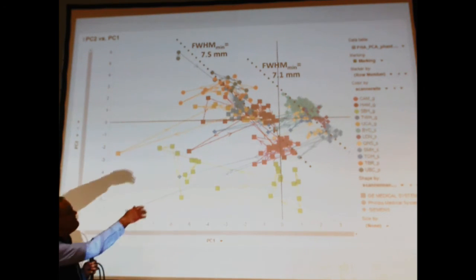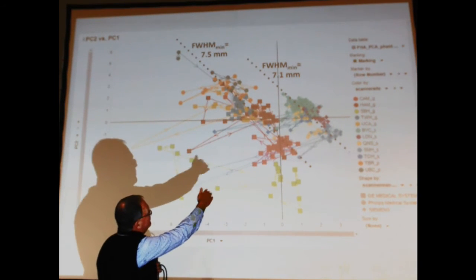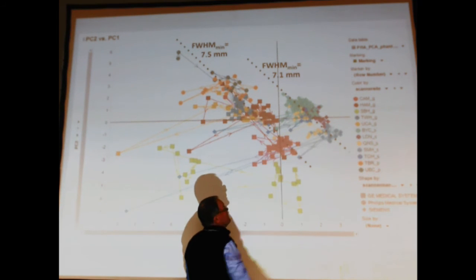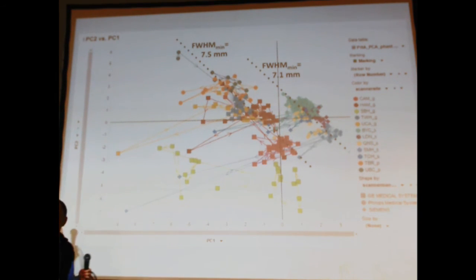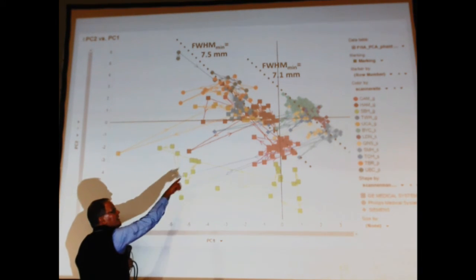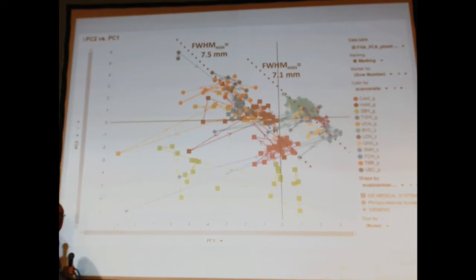So in fact we have on average got, these are all the GEs and Philips here, and they're the Siemens there. So we've certainly brought them closer together. So it's doing, first order, what you would hope it would do. But remember, that is a resolution direction. It's creating all these outliers. So it's done something good and something not so good. So we then decided we'd better work out what the not so good piece was.